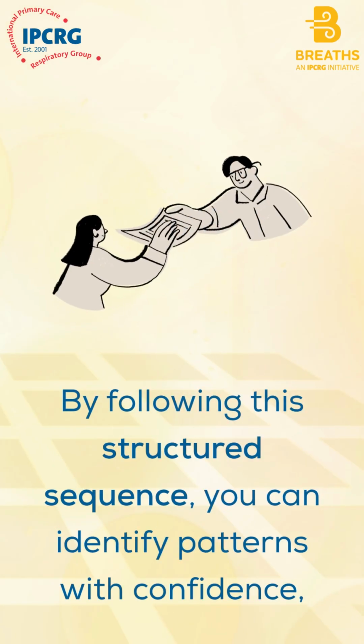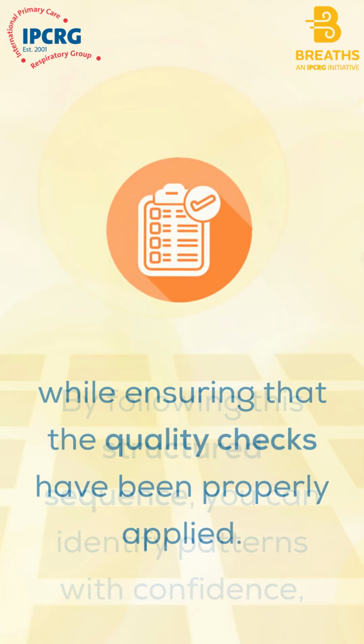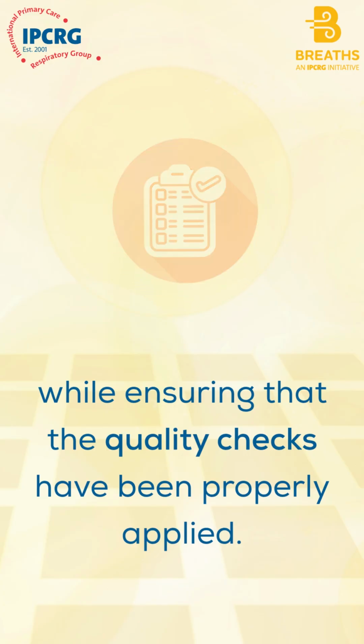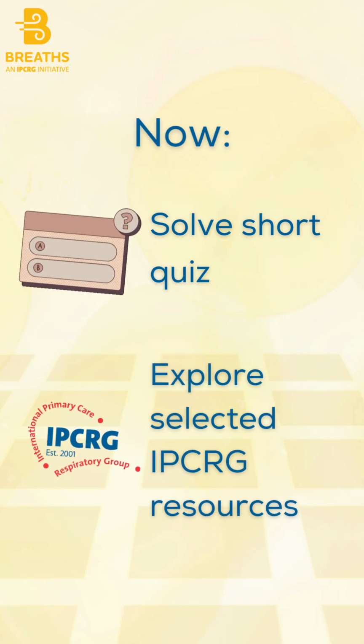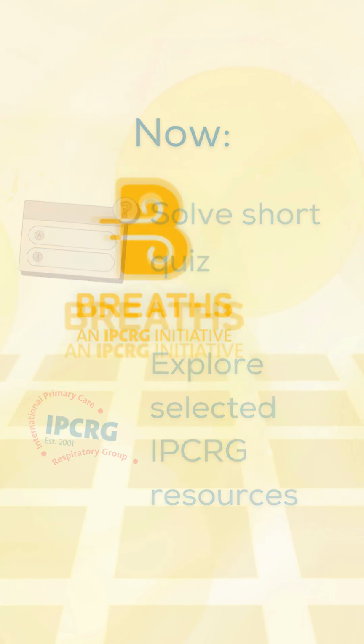By following this structured sequence, you can identify patterns with confidence, while ensuring that the quality checks have been properly applied. Now, time to solve a short quiz to reinforce your learning. A set of selected IPCRG resources will be available for you at the end of this video.